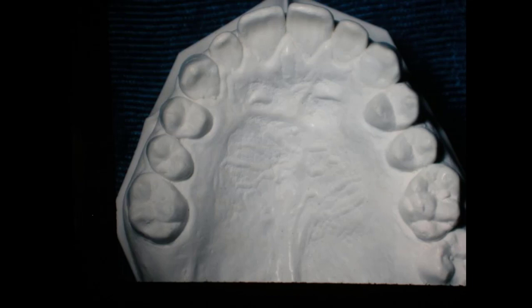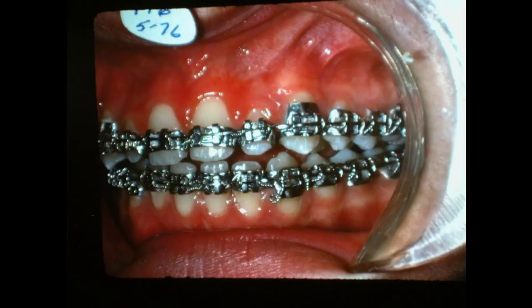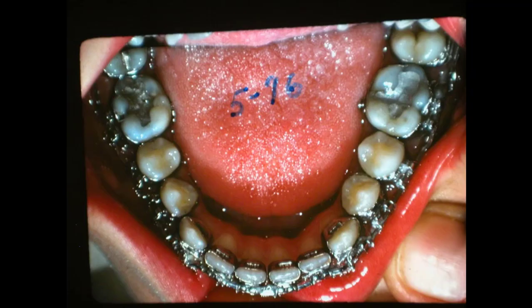Now that's out that way. Let's go through right quick. We got the bands and everything, and we worked here. We brought this cuspid out — there's a little eminence in the arch wire; the cuspid's thicker than the lateral.